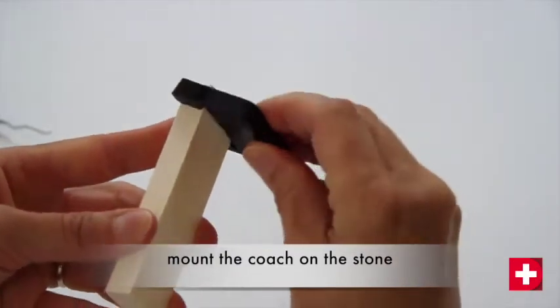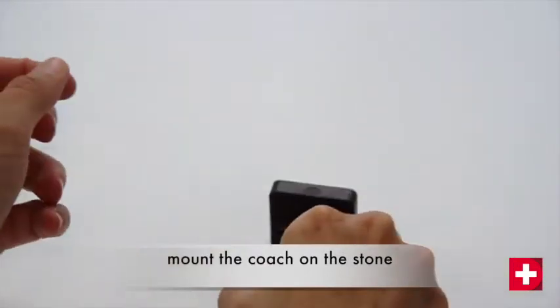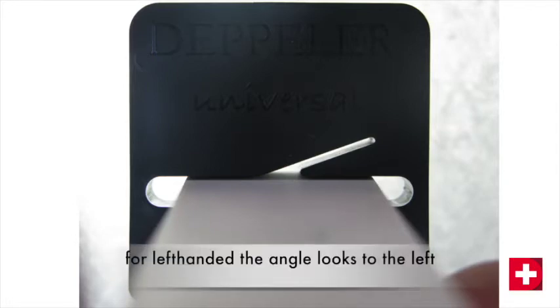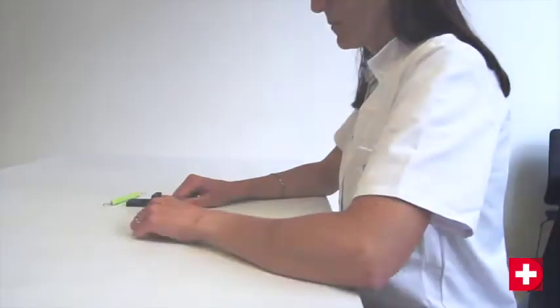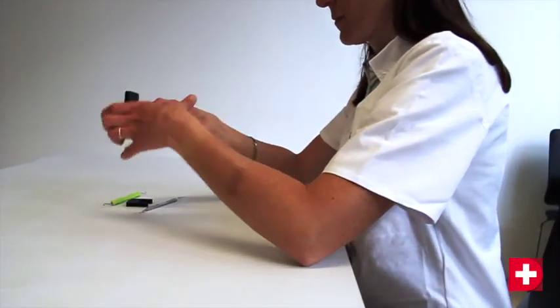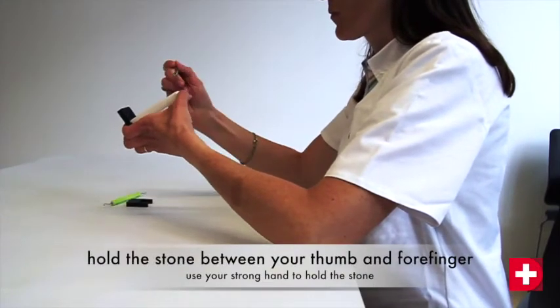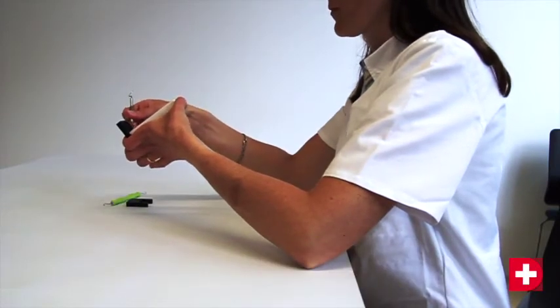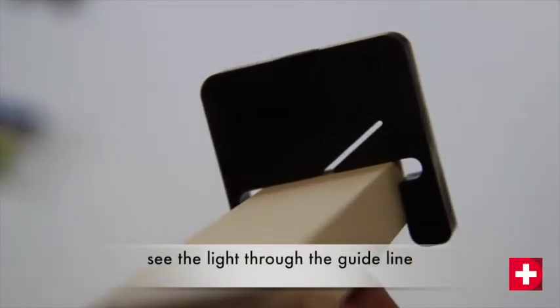First, mount the coach guide onto the stone. For right-handed users, the guideline points to the right. For left-handed users, to the left. In order to have a good view of the instrument on the stone, you should be sitting at a table and resting your elbows for added stability. Hold the stone between your thumb and forefinger so that you can see over the stone and look through the guidelines.